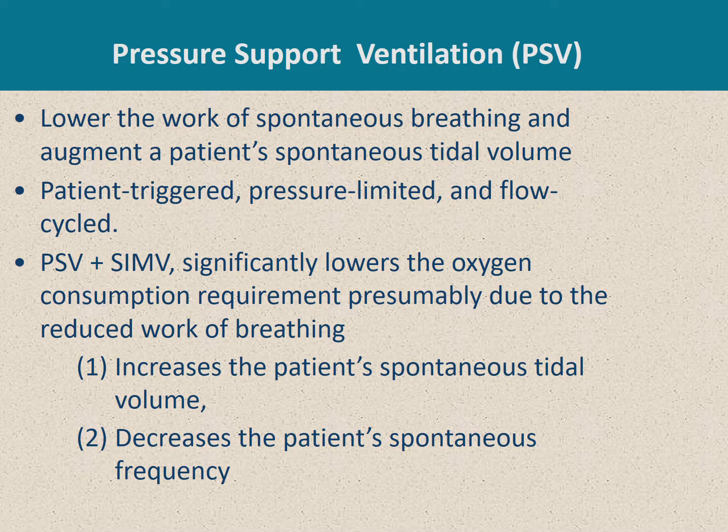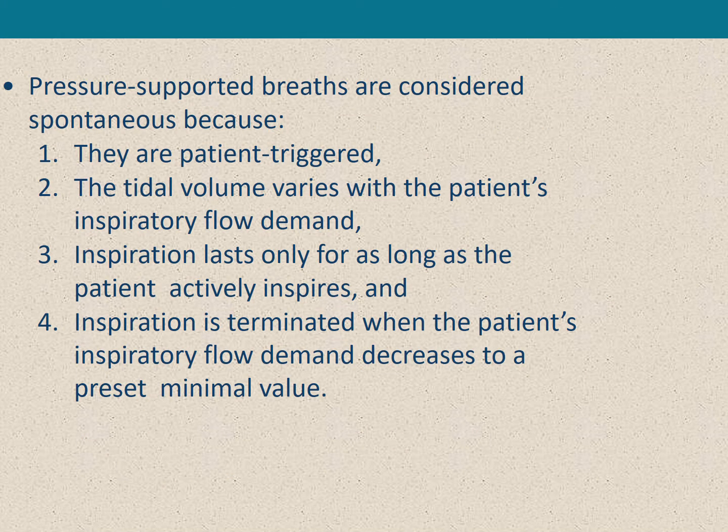Combining pressure support ventilation and SIMV significantly lowers the oxygen consumption requirement and may help reduce the work of breathing. Pressure supported breaths are considered spontaneous because they are patient triggered. The tidal volume varies with the patient's inspiratory flow demand.